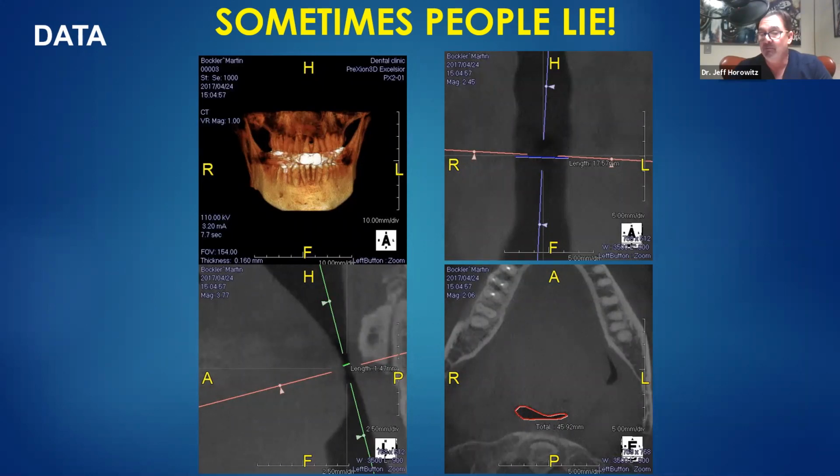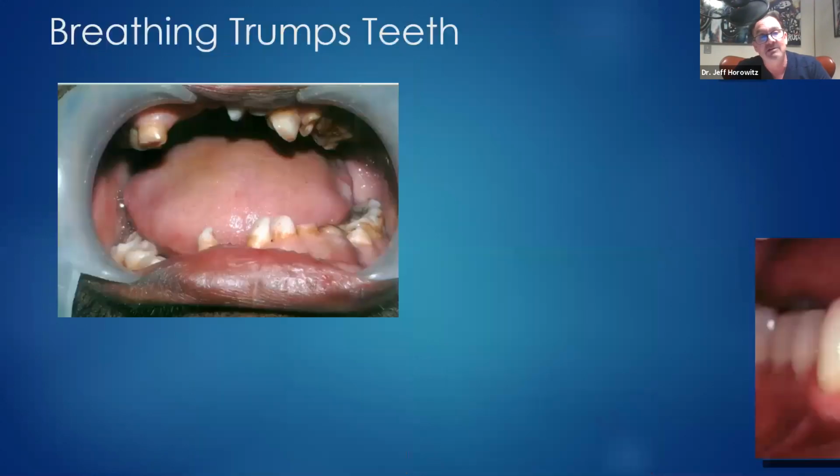And when we took our Prexion scan on Dr. Bachler here, and he has given me permission to do that, by the way, when we took our scan on Dr. Bachler, we see a critically small airway at the C2 region. And if we look at it from the axial view, you can see that it's almost entirely collapsed. This is while he is standing upright and breathing in and out. As it turned out, not just apnea, but severe apnea was the diagnosis.